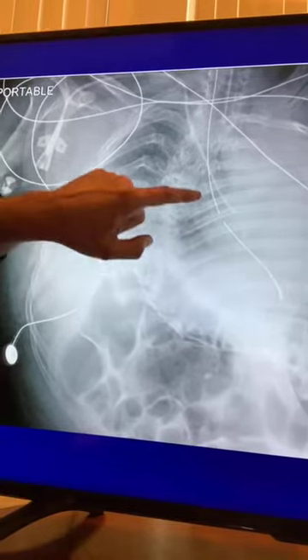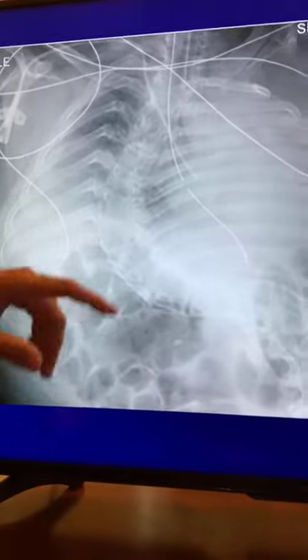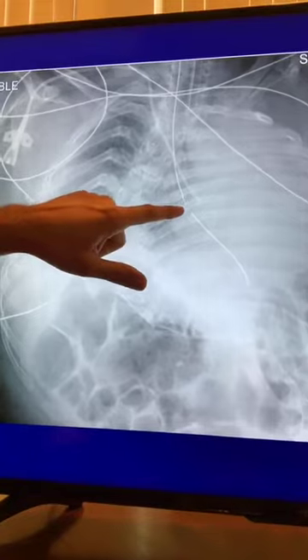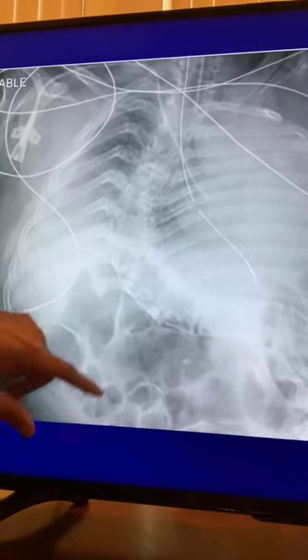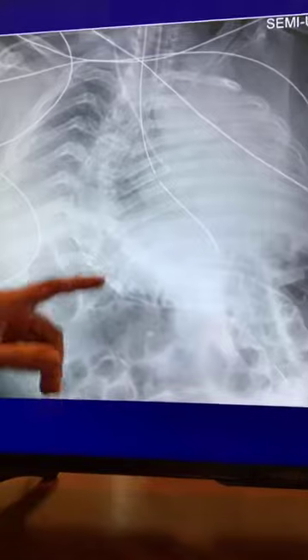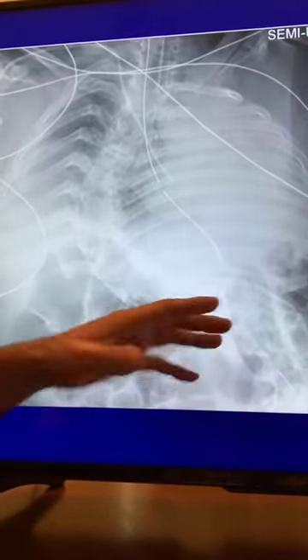If you're not too sure about it, you can call it an enteric tube, because enteric means in the bowel. But yeah, this is an NG tube. Again, it always has this side port right here. You do not really want this side port to be in the esophagus, so you want it to go further down into the stomach. But anyway, you know this is the NG tube. And hey, look, that's a big context clue, right? Because you're saying, all right, well, this is going down into the stomach. So the stomach may be situated normally-ish. It may be over in that area.